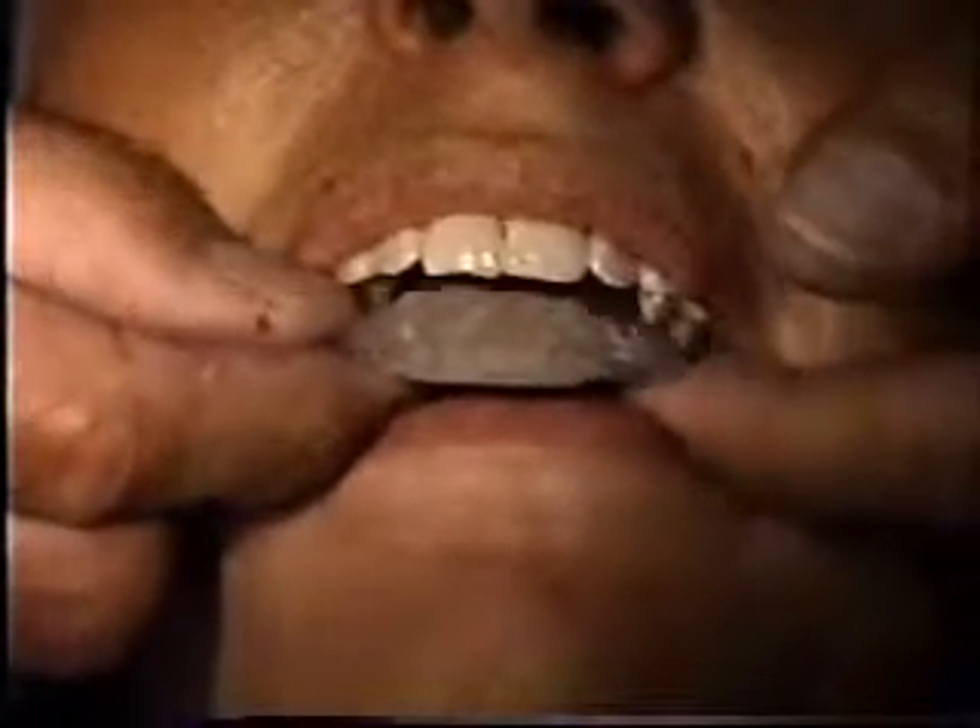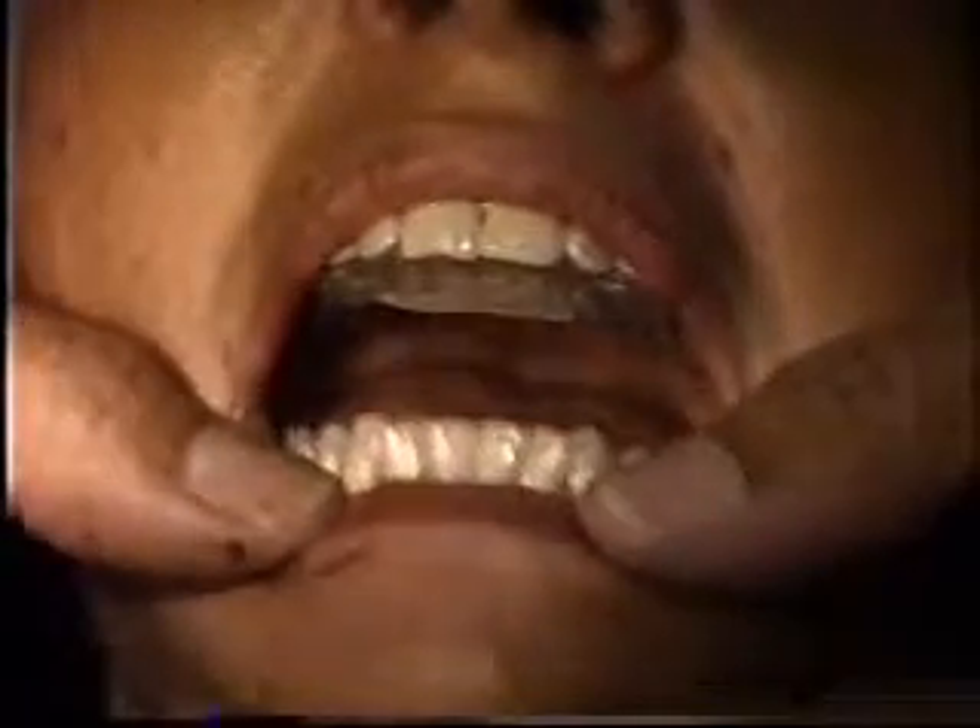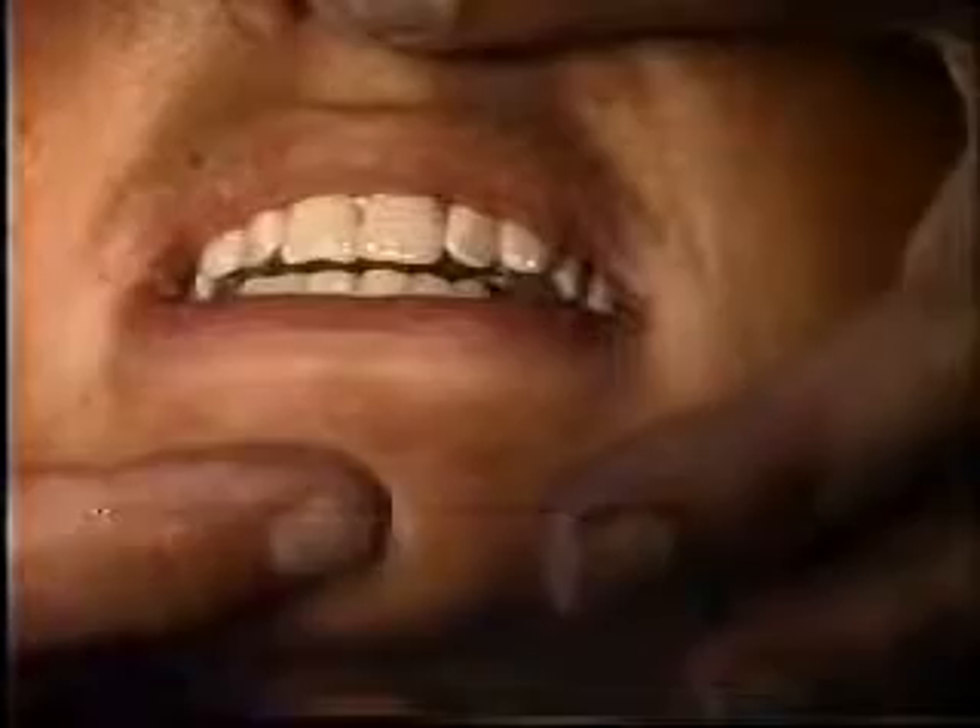Bite splint — a plain holly type bite splint with no wire, which fits in the palate and catches on the anterior teeth. The jaw comes forward to reposition the jaws and try to set up a new vertical dimension and space between the nose point and the chin to change the vertical dimension.